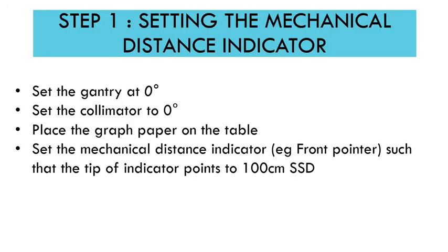Let's go through the step-by-step procedure. Step 1: set the gantry to 0 degrees, set the collimator to 0 degrees, place the graph paper on the table, and set the mechanical distance indicator — the front pointer — such that the tip of the indicator points to 100 cm SSD.